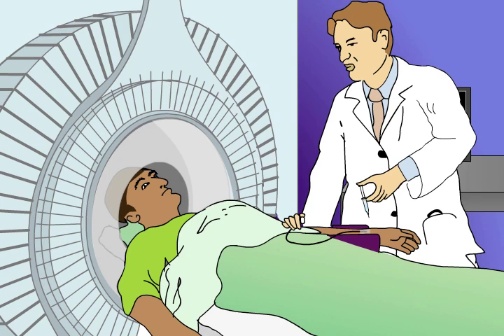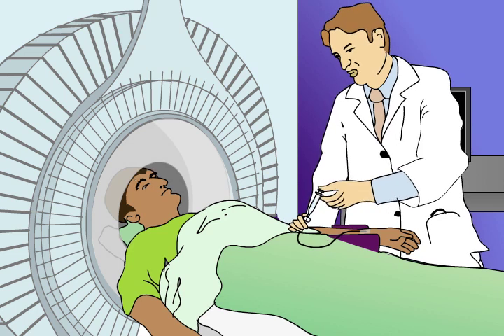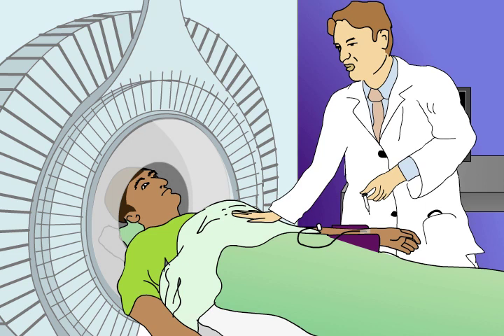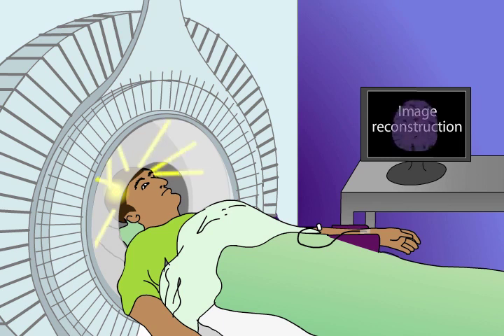In positron emission tomography, or PET, the objective is to obtain images of the brain's activity rather than details of its structure. To do this, short-lived radioactive chemicals are injected into the bloodstream of a subject or patient, and a ring of detectors maps the destination of these chemicals in the brain by sensing the emission of radiation in the form of gamma rays.